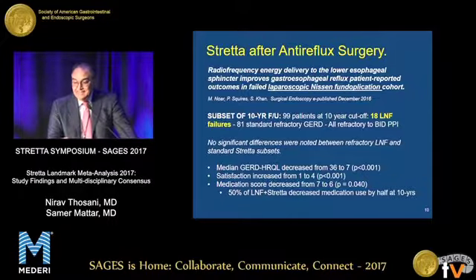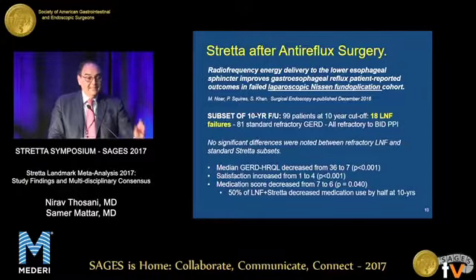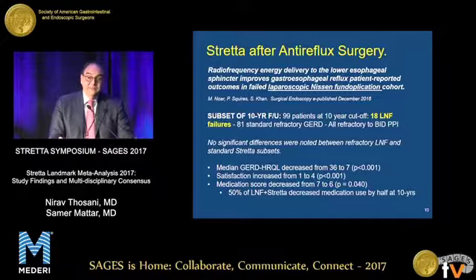This is a study from here in the United States where Stretta was applied for patients after anti-reflux surgery, not bariatric surgery. And these patients had received laparoscopic Nissen fundoplications. There were about 100 patients, 18 of whom had laparoscopic Nissen fundoplication. And the idea was to compare that sub-cohort of patients with other patients who were receiving Stretta for the typical symptoms of GERD. And they found that in this population, there was no significant difference in the quality of life scores, and satisfaction increased in both groups, and the medication scores decreased in both groups equally, meaning that there was no harm, or there should be no limitations in offering this therapy to patients after anti-reflux surgery.